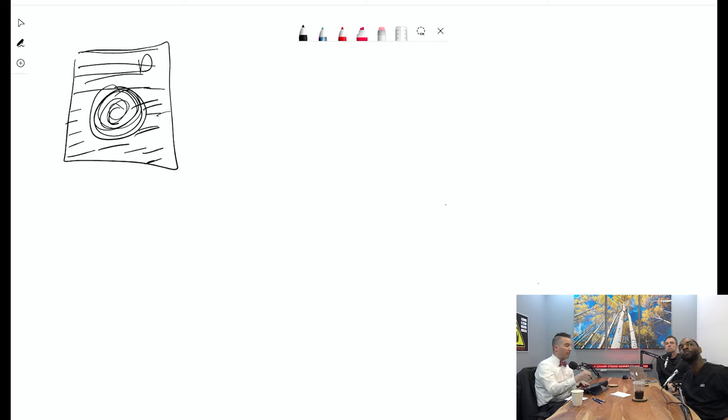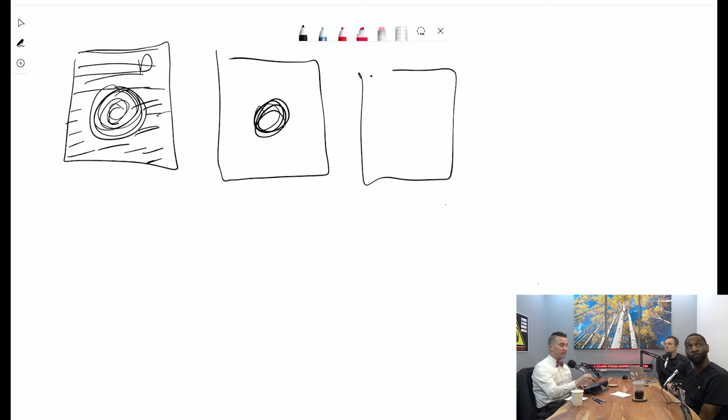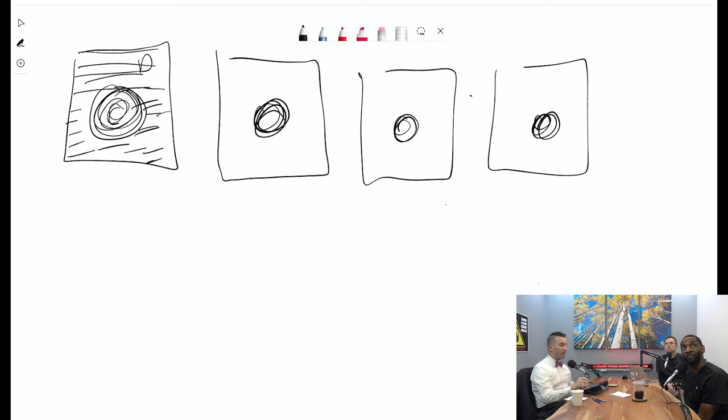The idea is that after that's finished on a direct keyhole filling, at that point it's basically just a copy and paste. The patient's overall anatomy is static and not changing. The only thing that's changing is the contrast that's flowing in. So in a regular keyhole, we just fill the middle and fill the middle, and we have a very, very high temporal resolution, meaning we're getting each of these. It doesn't take very long to go from one 3D to the next.